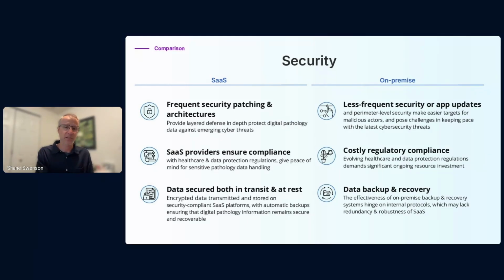In the case of software as a service, multi-site distributed backups are the norm. And it's still important to ask about this when you're evaluating vendors, but I would expect they would all have a good answer to this that ensures the integrity of your data over time.